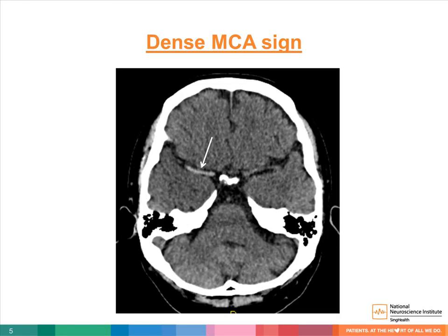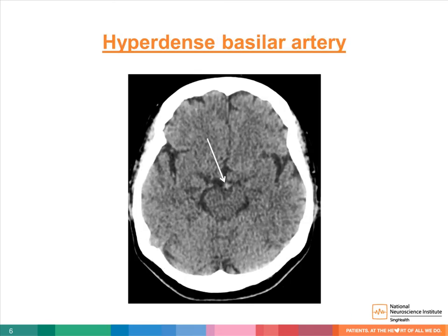In the event of an acute ischemic stroke, you can sometimes see a dense MCA sign. In this example, there is a dense right middle cerebral artery. In this example, there is a hyperdense basilar artery.